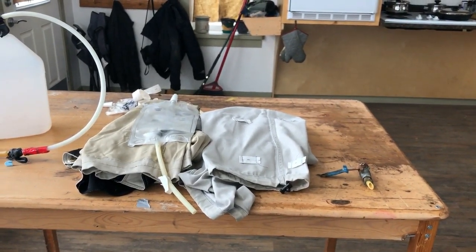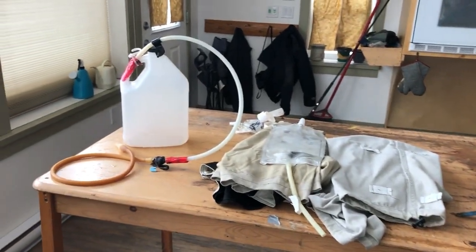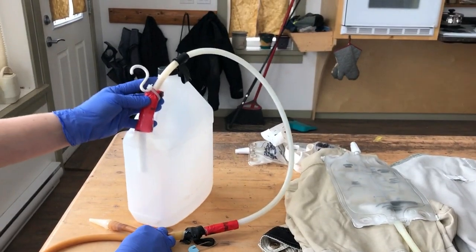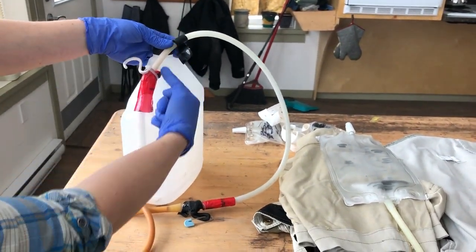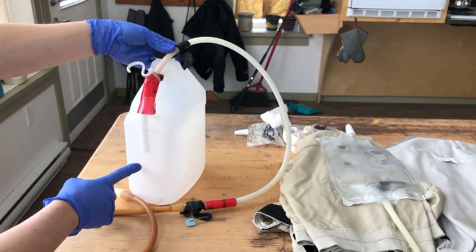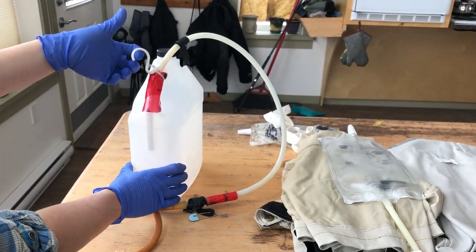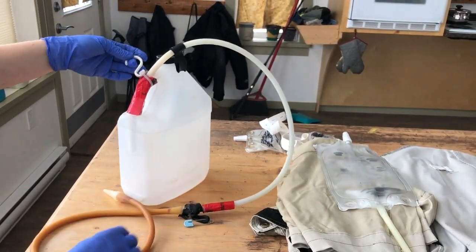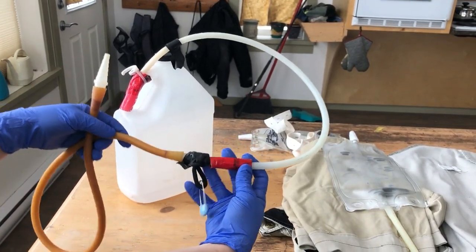So while we're on drainage bags, for a night drainage bag, I use a vinegar jug. And the vinegar jug, I cut a hole in the handle and I jammed a piece of winemaking hose down into it. And I use winemaking hose because it's pretty tough stuff and it doesn't crimp over and pinch. And also to the handle, I have zip tied a little hook on so I can hook it onto the bed. And so half the way up the hose length, I've spliced in a piece of surgical tubing.